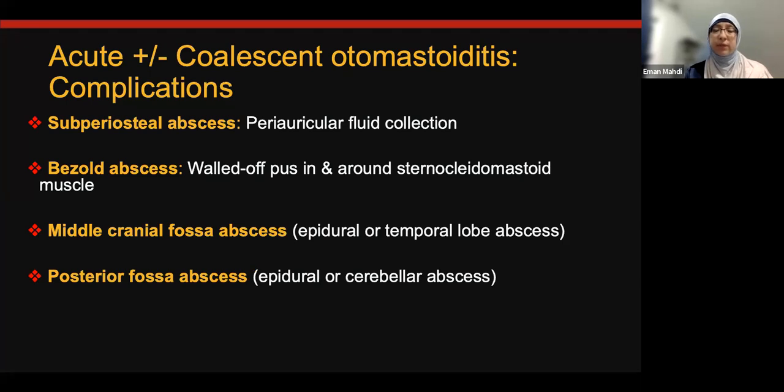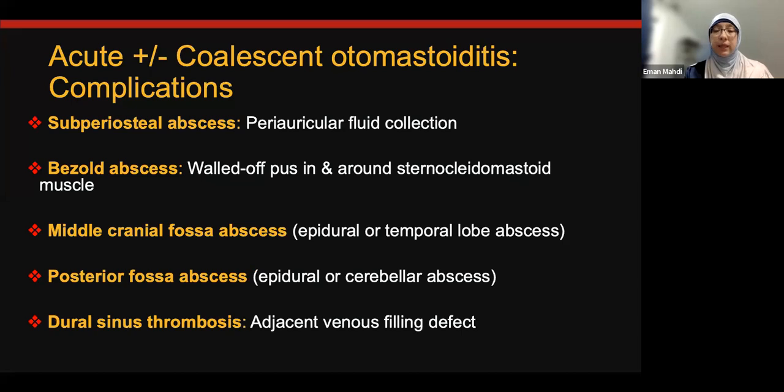The same for the posterior fossa, so epidural collection or cerebellar abscess. And then always the important thing that you should check is dural sinus thrombosis.